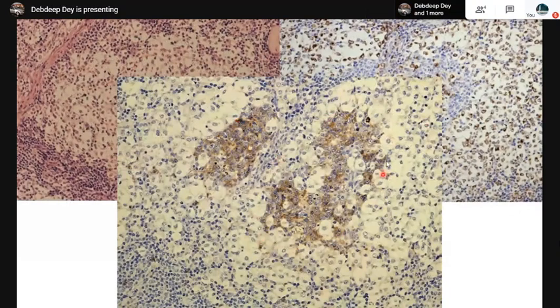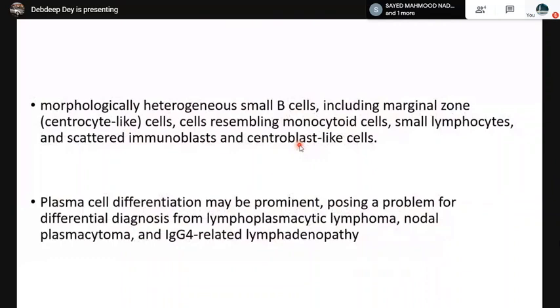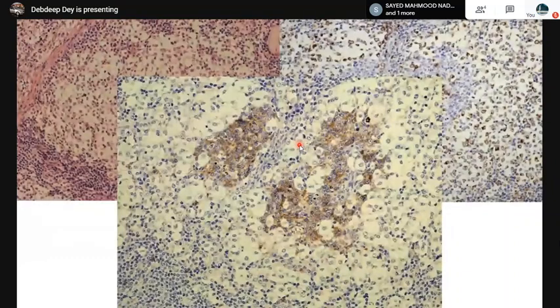What is showing is the CD10 positive and surrounded by, which is the atretic germinal center. And this is what is characteristic. You will have an atretic germinal center surrounded by these CD20 and BCL2 positive cells, which are going to be your neoplastic B lymphocyte population.